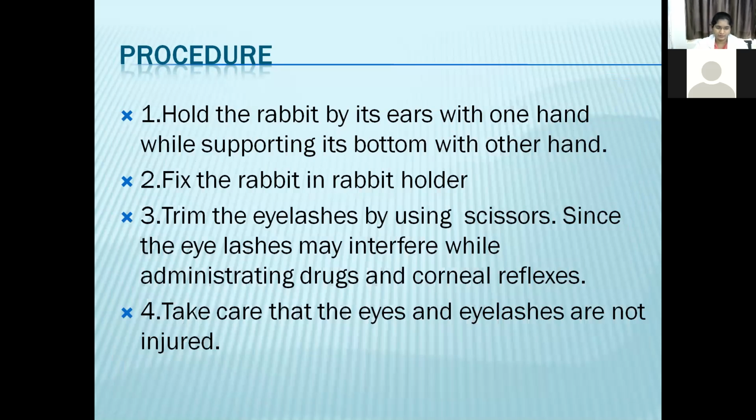And fix the rabbit in the rabbit holder. Trim eyelashes by using scissors, since the eyelashes may interfere while administering drugs and with corneal reflexes. So we have to trim eyelashes with scissors before going to the practical. Take care that the eyes and eyelashes are not injured.